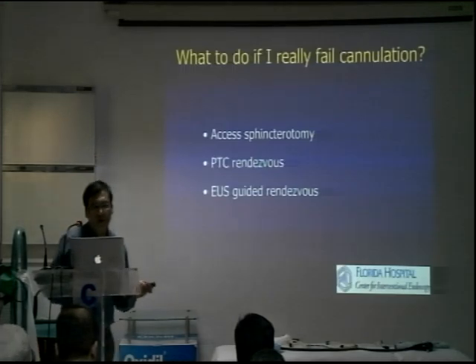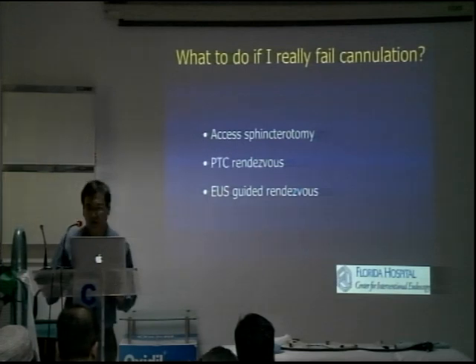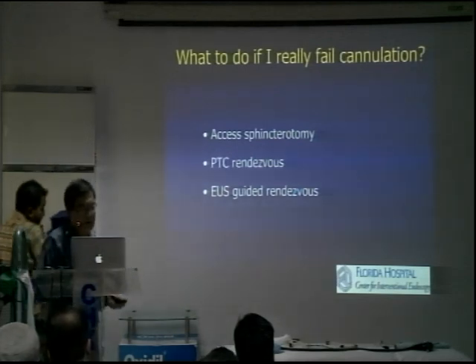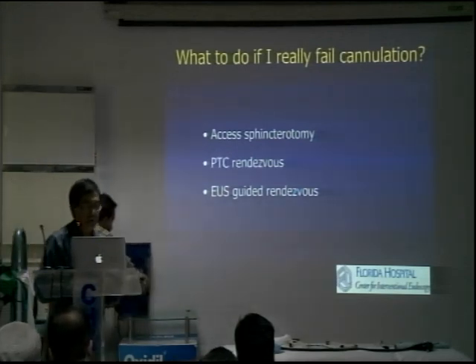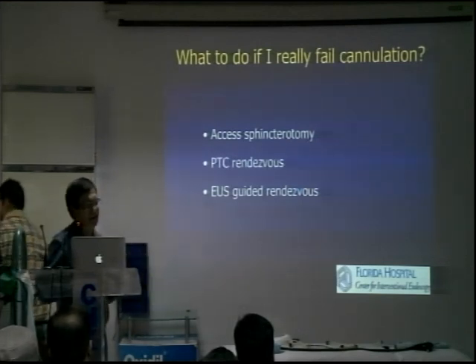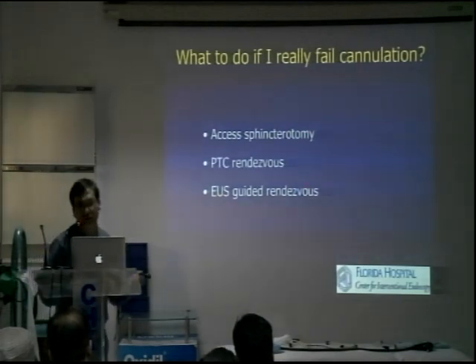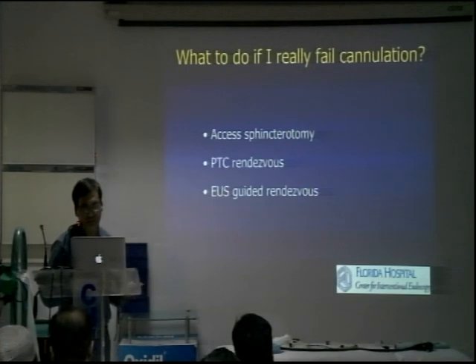Okay? So what to do if I really fail in cannulation? You can do an access sphincterotomy or a pre-cut. You can do a PTC rendezvous or EUS guided rendezvous. So here and there, once in a while, I have to do a rendezvous, but I use EUS to do that rendezvous during the same session.